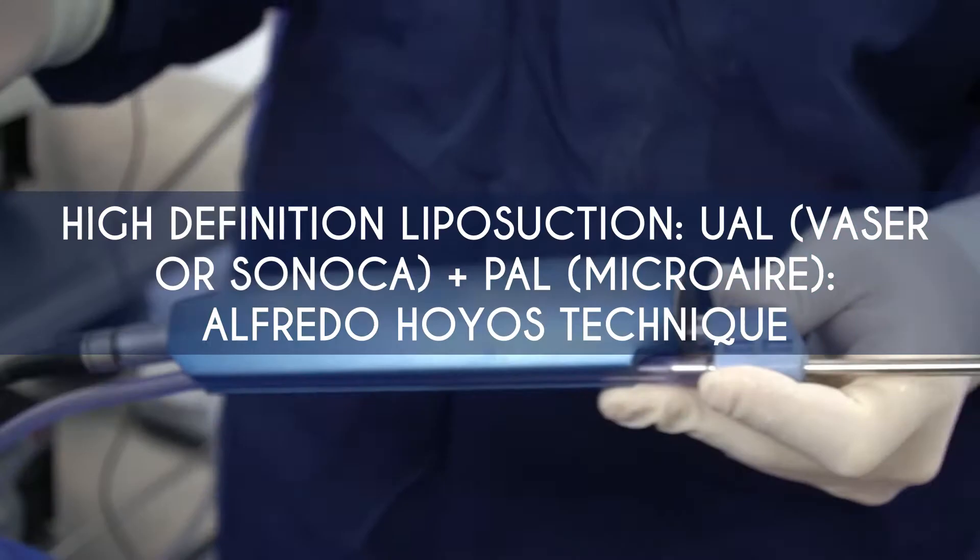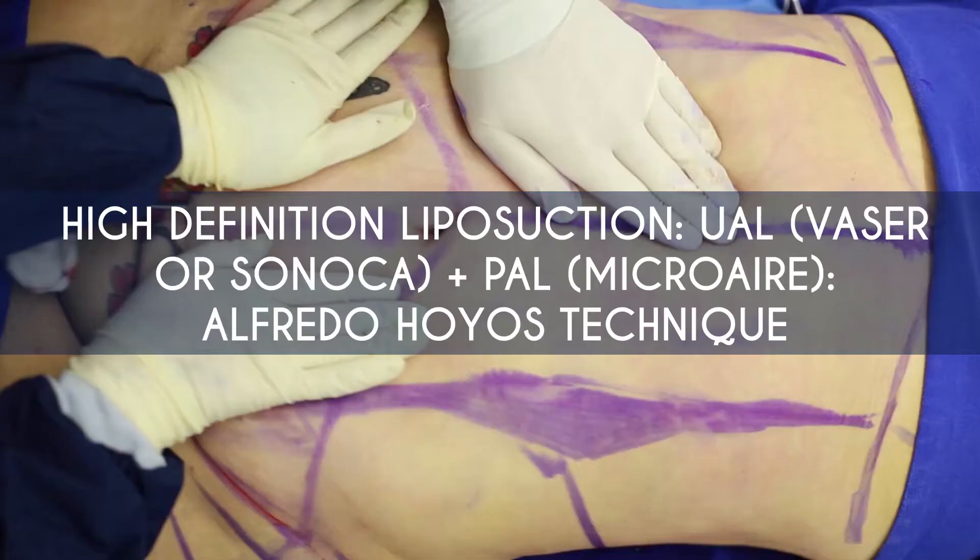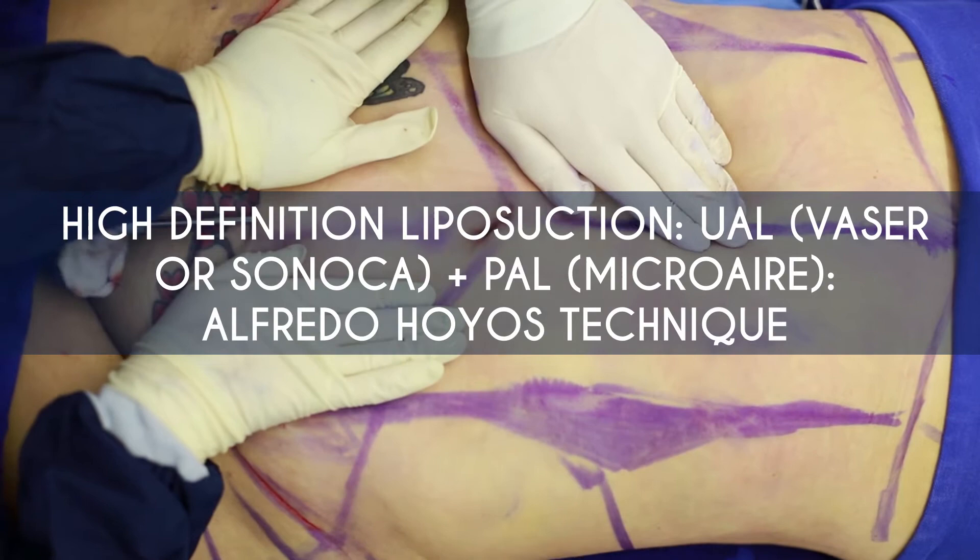So these are the before photos. We start with doing liposuction — Dr. Hoyos technique. We use some technology to help us and this is the way we do liposuction.